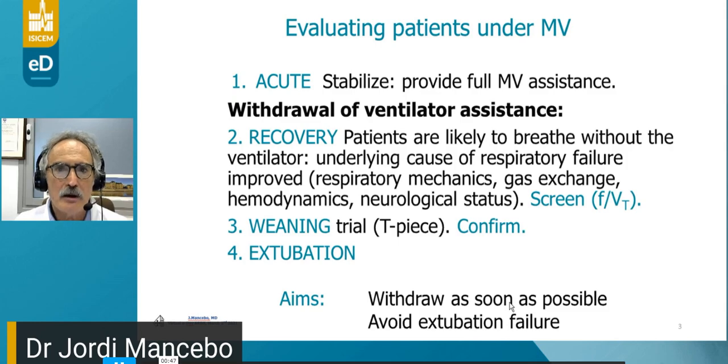Once the patients are intubated and mechanically ventilated, immediately after the trachea is intubated, our main aim is to stabilize these individuals, providing full mechanical ventilator assistance, often with sedation, sometimes with muscle paralysis, and with relatively high intensity of assistance in terms of oxygen and pressures delivered to the respiratory system.